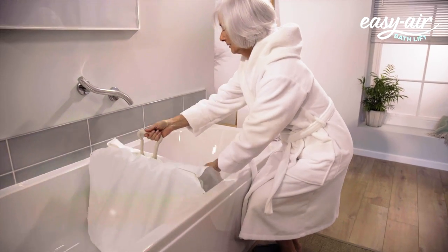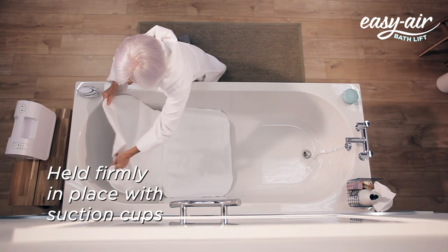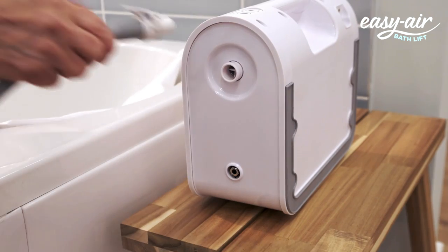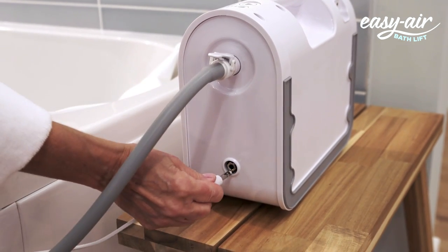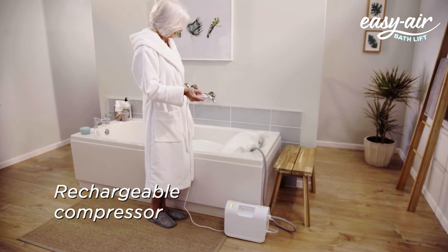The Easy Air Bath Lift can be used with all standard baths, so there's no need for bathroom alterations. Simply lay it out in your bath and four suction pads hold it firmly in place. It's so easy to connect the hose and handset to the airflow compressor, plus the compressor is rechargeable, so no electrical cables are needed in the bathroom.